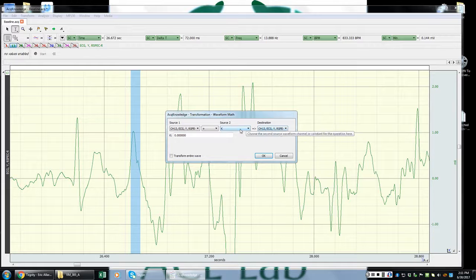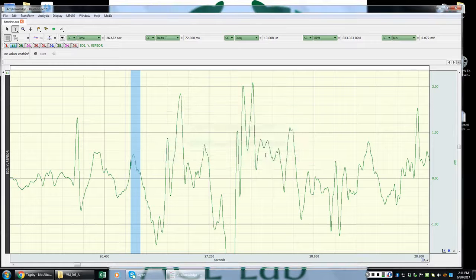The K you're not going to change. K is just a constant, and we usually do a little bit of trial and error in terms of what we should have as our K constant, depending on whether you're adding, subtracting, multiplying, or dividing. Typically, we use division for bringing down the waveform, and I'm going to show you two examples of that here. I'm going to start just with the number 2 as my K and see how far down that drops this waveform. Click OK. It did a pretty good job of dropping that down.